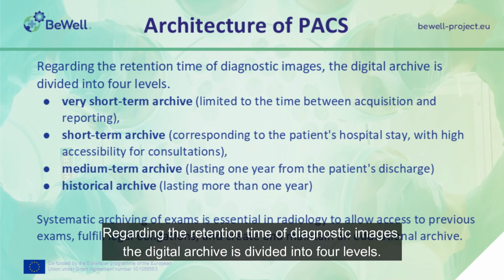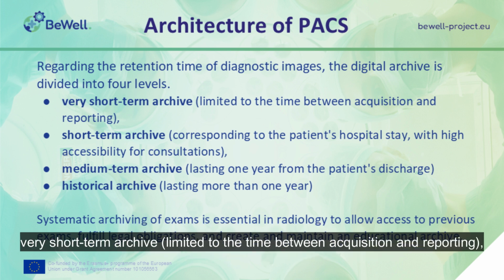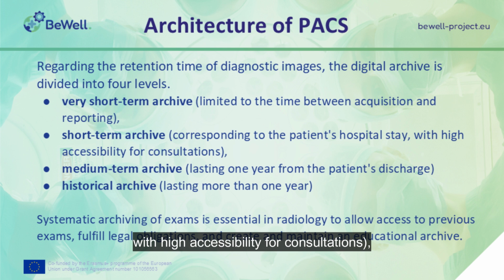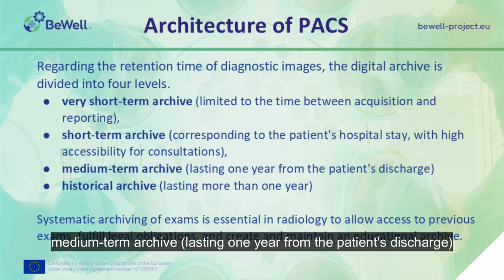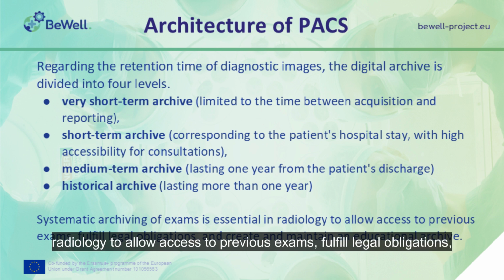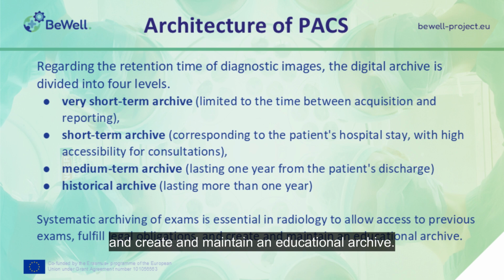Regarding the retention time of diagnostic images, the digital archive is divided into 4 levels. Very short-term archive, limited to the time between acquisition and reporting. Short-term archive, corresponding to the patient's hospital stay, with high accessibility for consultations. Medium-term archive, lasting 1 year from the patient's discharge. Historical archive, lasting more than 1 year. Systematic archiving of exams is essential in radiology to allow access to previous exams, fulfill legal obligations, and create and maintain an educational archive.